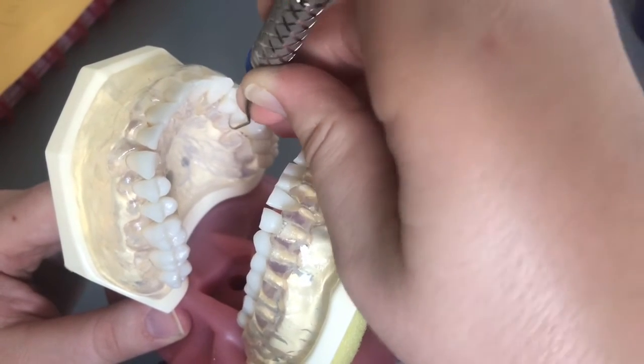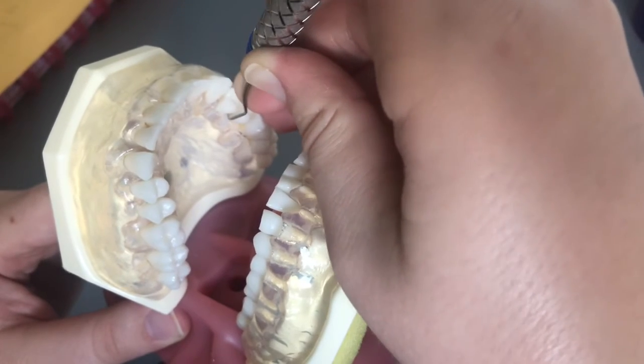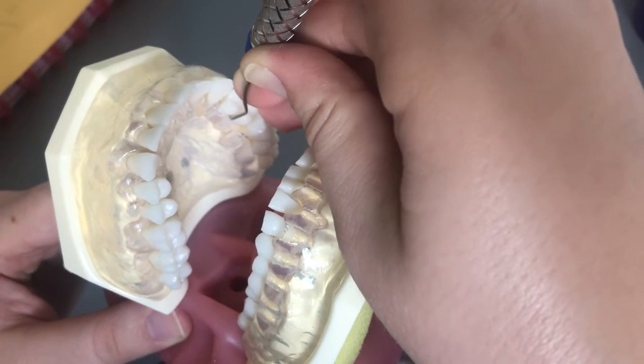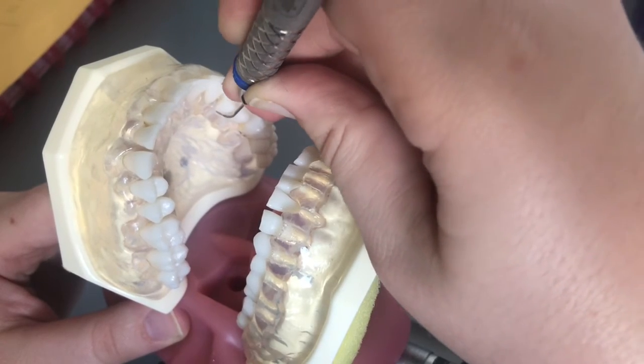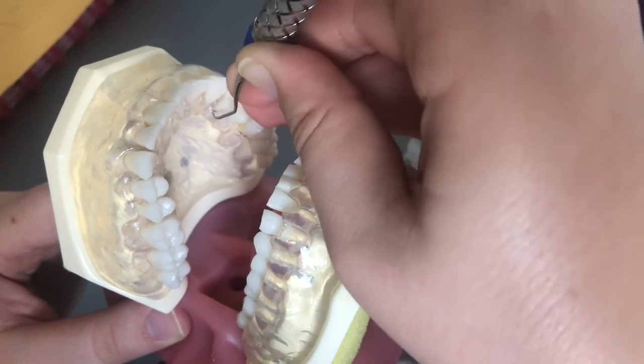Again, trying to be as parallel with the tooth as possible while also keeping the correct hand positioning.